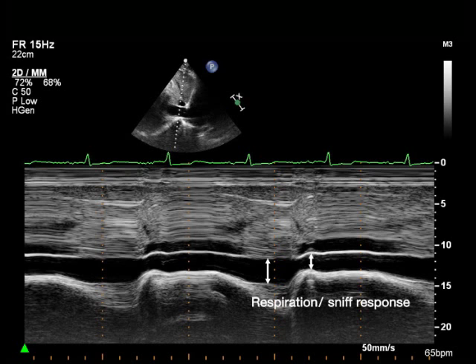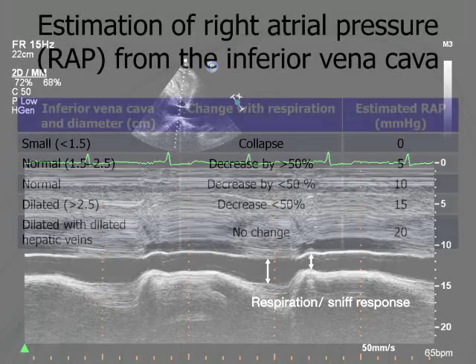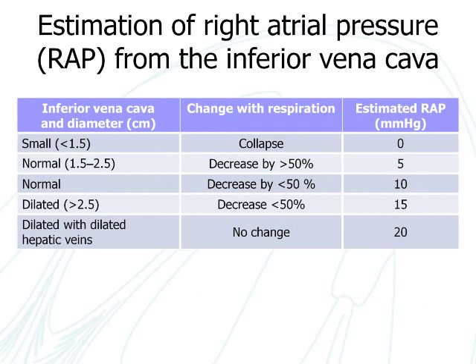Failure to collapse with respiration and sniff, and/or dilatation of the inferior vena cava and hepatic veins, is associated with higher right atrial pressure. Right atrial pressure can therefore be estimated based on the size of the vena cava and the change in respiration, as shown here.